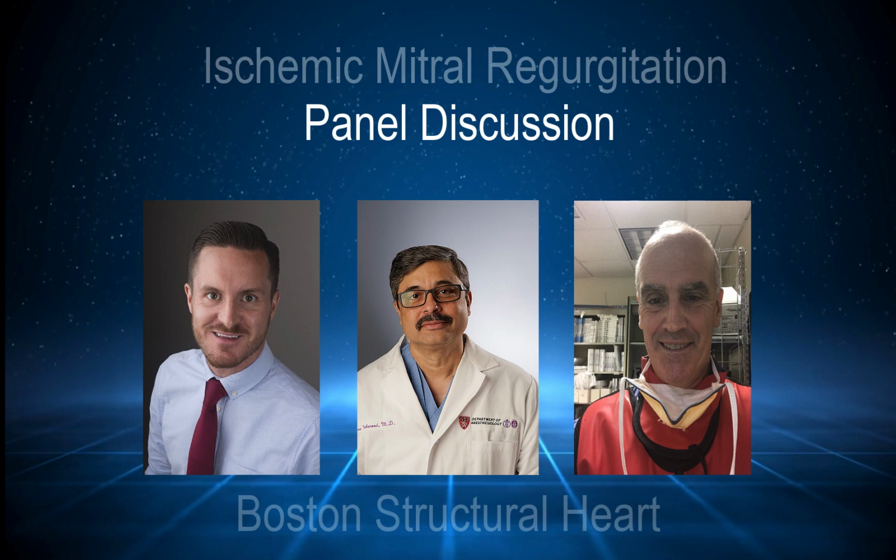But you can do this vena contracta in everyone, and 4 to 6 beat reconstruction in patients with atrial fibrillation and arrhythmias and breathing interference is sometimes impossible. Sometimes these patients have these problems, so that's why I'm a little reluctant. Also, the grayscale information and the Doppler information are not synchronously acquired.